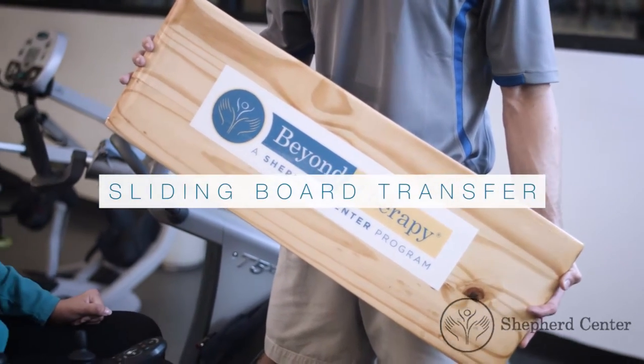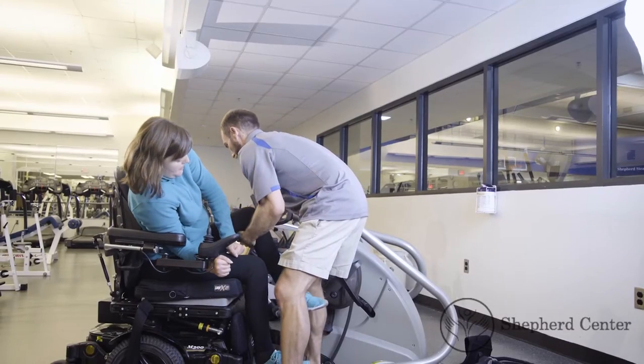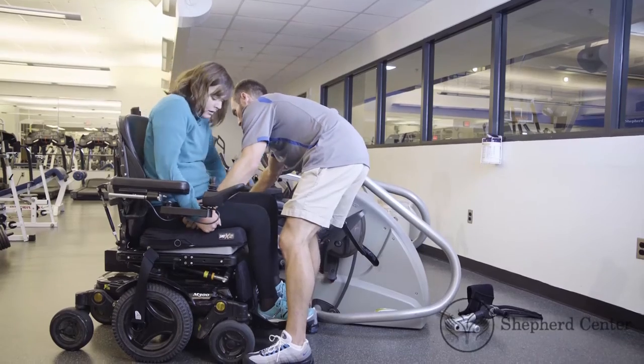Sliding board transfer. Have the participant lean to one side and slide the sliding board underneath their body. The sliding board should bridge the gap between the two chairs.